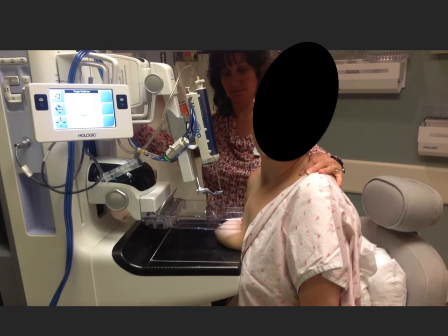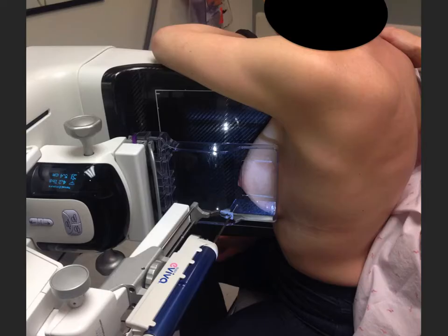This is a patient who has been positioned for a cranial caudal approach for a tomoguided biopsy. You can see our compression plate here with the hole in it. Note that you always want to put some good padding behind them to make sure that the patient doesn't move. Make sure they're comfortable before you start. And here is a patient who has been positioned for a lateral approach. The same applies. We will often put sterile tegaderm between the paddle and the patient. This helps the breast compress and also stops the patient's breast from moving within the device during the biopsy.